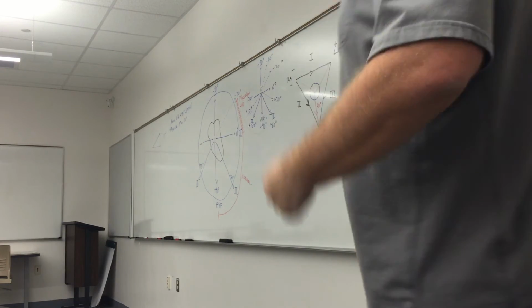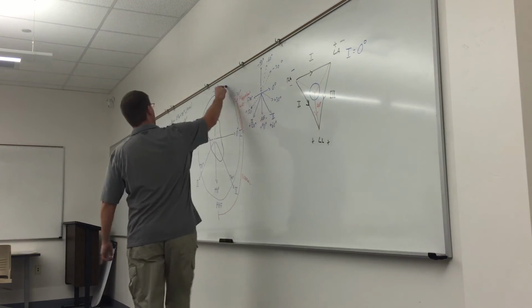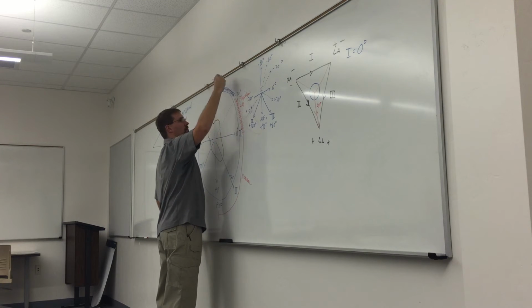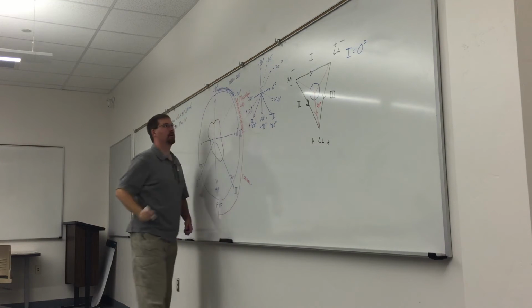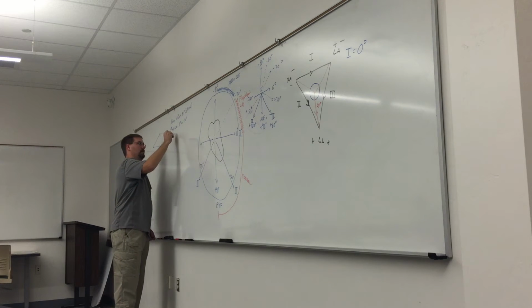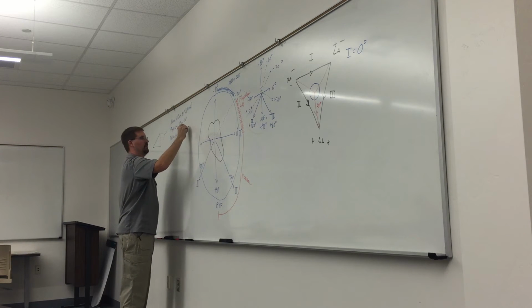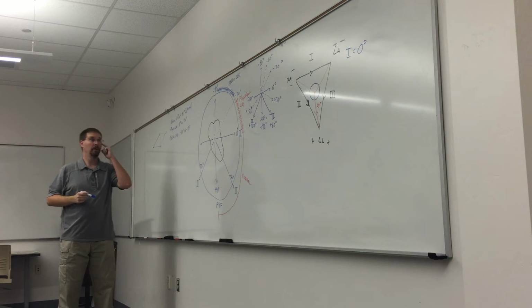90 to 120. Negative 90 to. There you go. Yeah, you're close. Negative 30 to negative 90. So up here, and I'll draw this in blue, this is going to be pathological LAD. You guys all right with that? So pathological left axis deviation is going to be from negative 30 degrees to negative 90 degrees. So far so good? All right.